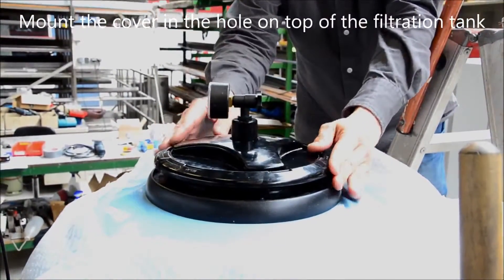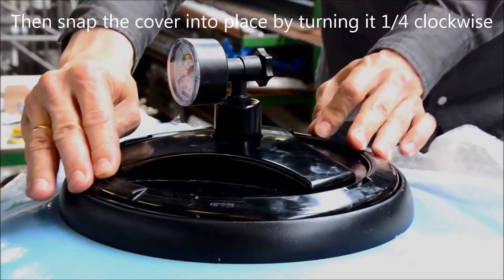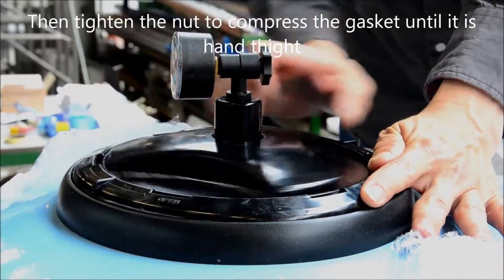If necessary, slightly loosen the nut. Then snap the cover in place by turning it one-fourth clockwise. Tighten the nut to compress the gasket until the nut is hand tight.